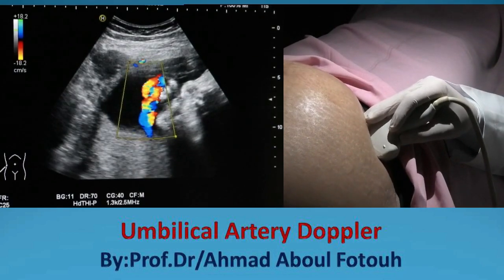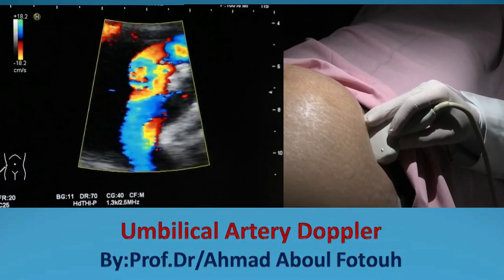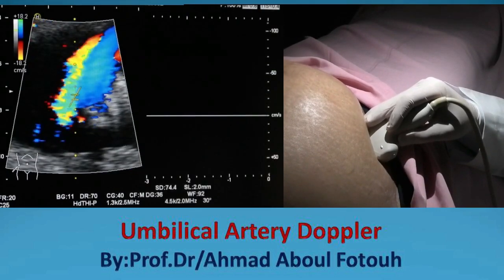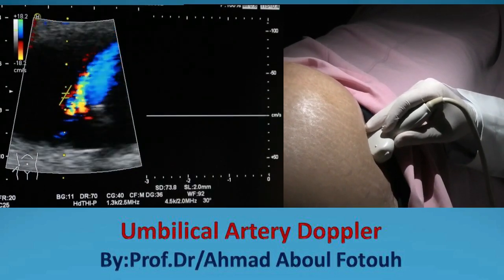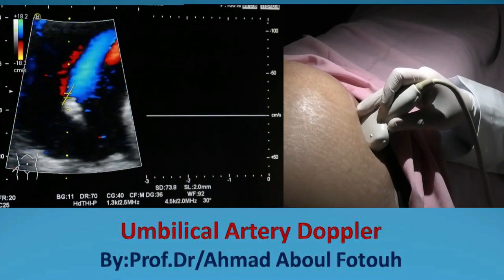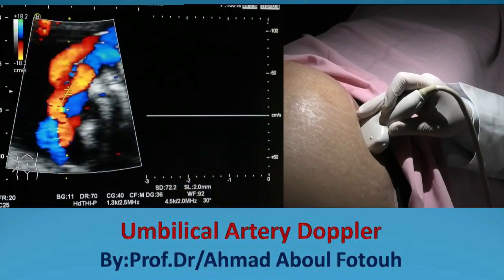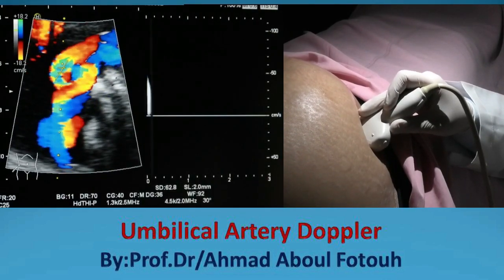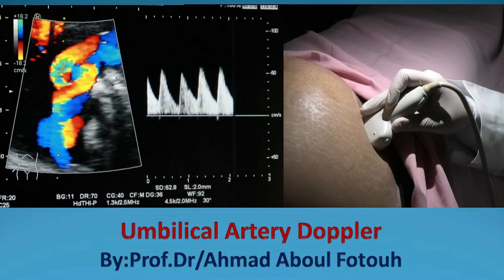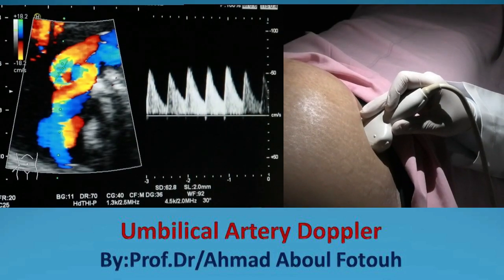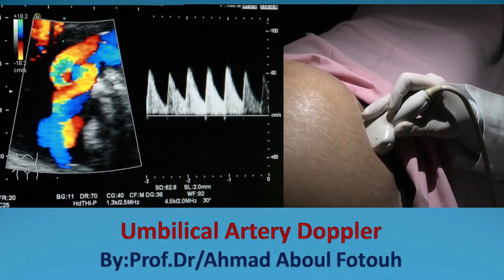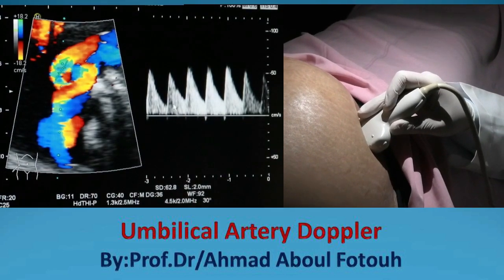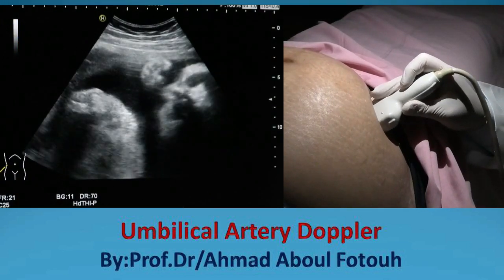Then apply color Doppler in a good area of the cord to maximize visualization and get a good axis. Adjust your hand to check the vessel area of this artery and get a good spectral flow. One very important point — look at this variation, which is normal due to patient breathing and movement.